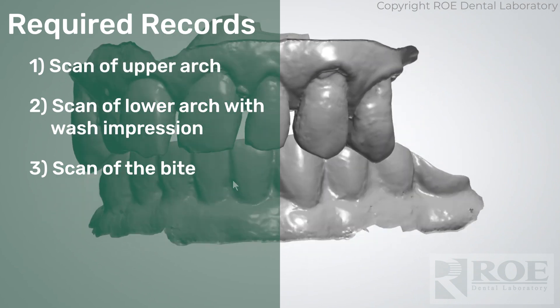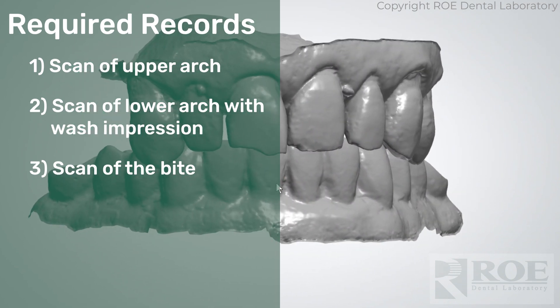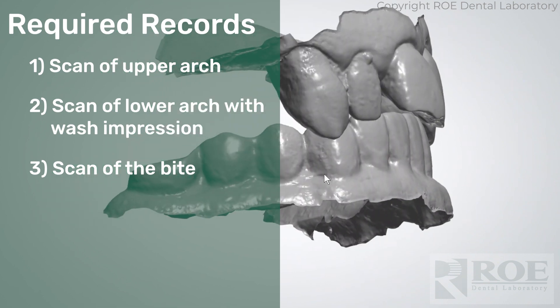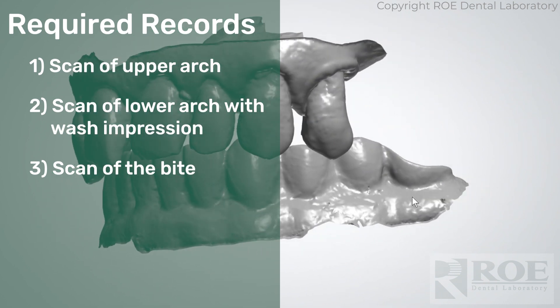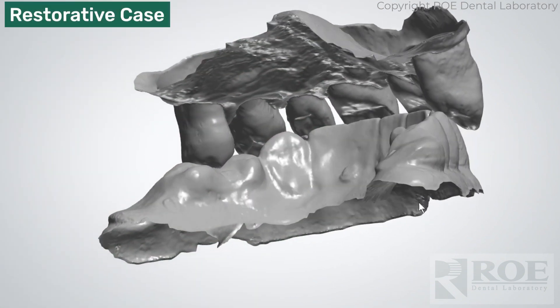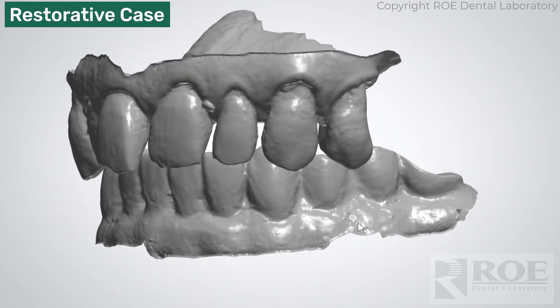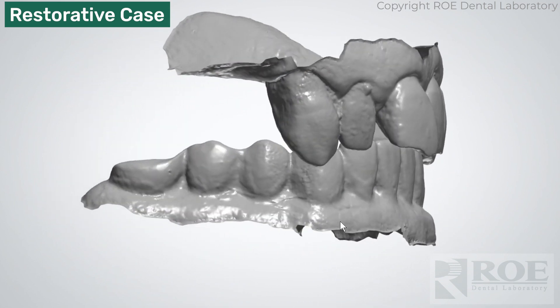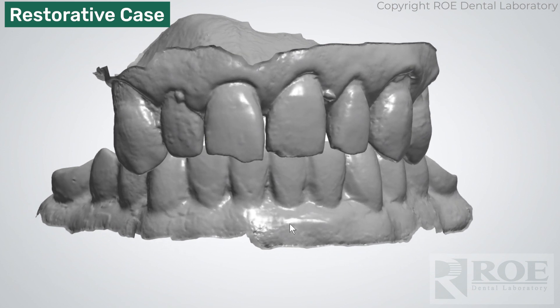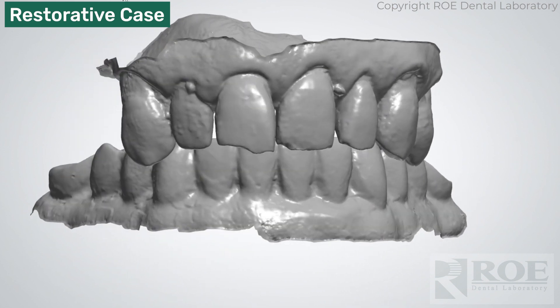These are upper and lower scans of the complete arch. This case is a lower hybrid and just upper natural teeth, so the lower is what we're going to replace. The doctor scanned the teeth and just scanned the tissue part of the prosthesis on the lower. We basically just need to be able to orient other files into this bite — that's the first scan the doctor took.